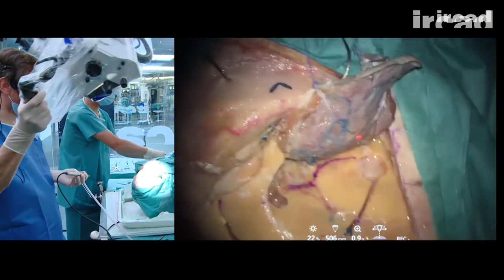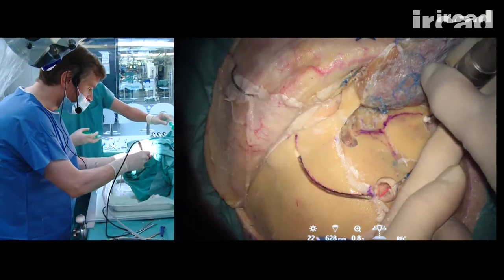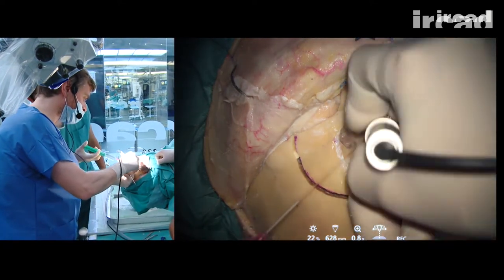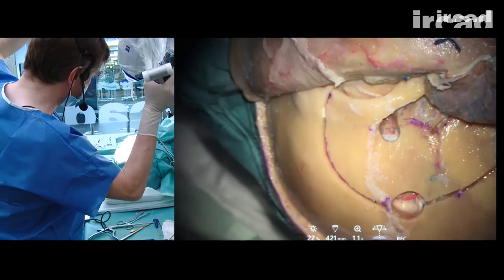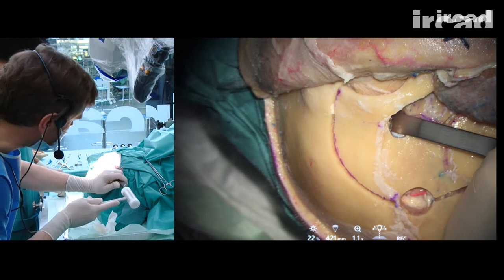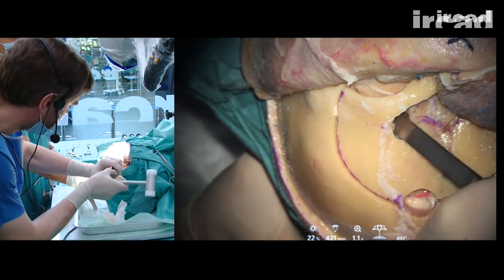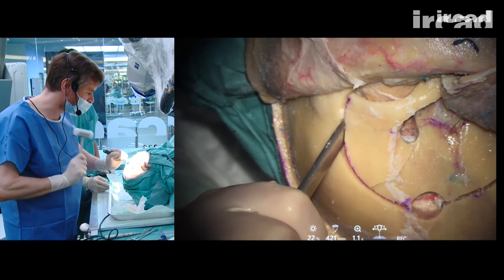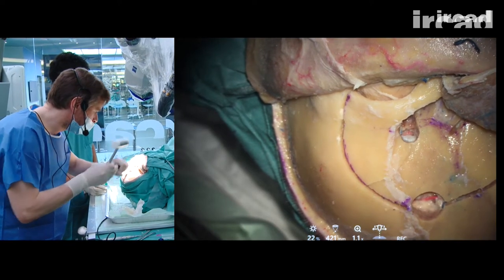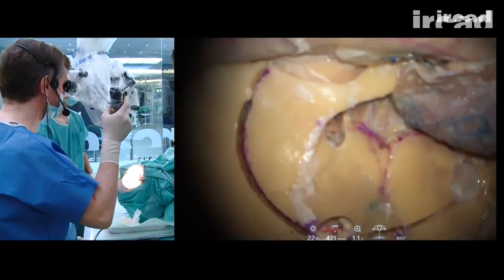Now I have to go in the temporal area and work on the inferior aspect of the craniotomy. And here also, I need to do my final cut of the orbital roof. Unfortunately, I don't have a small chisel. Unfortunately, there was a break here, which can happen sometimes. Okay. And now I will drill here the last part.